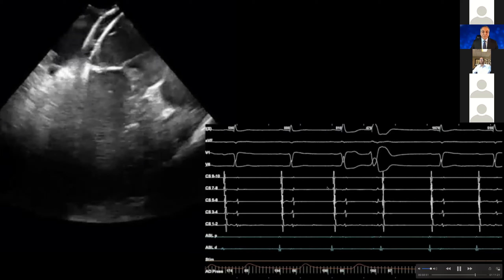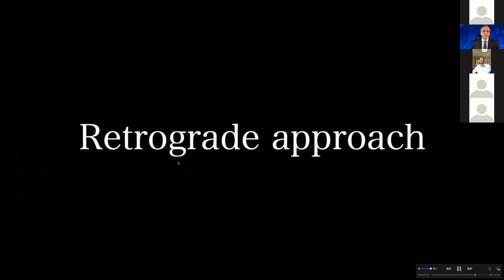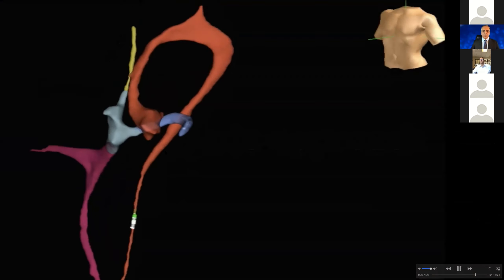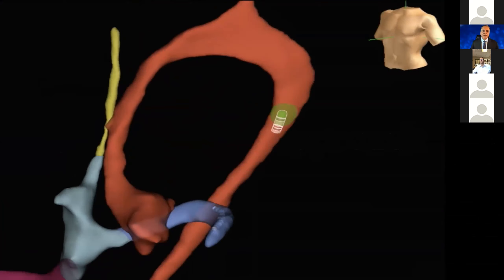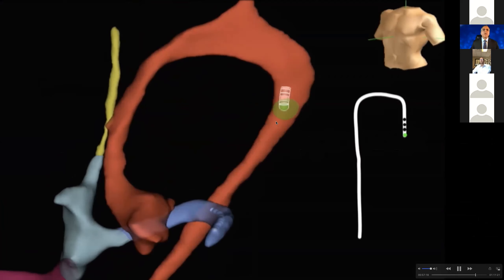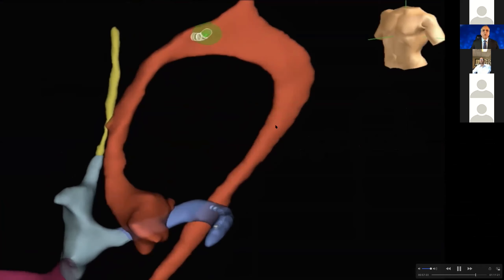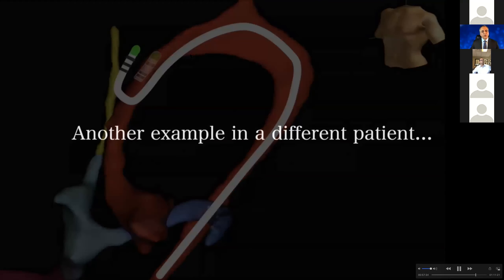Here you can see that there are no more atrial tachycardias. So lastly, we are going to talk about ablation of LV PVCs. Either you can go retrograde or antegrade approach depending on where you think your PVCs are. But I almost always perform the U-curve and candy cane inside the descending aorta — I believe it is much safer to do so. I am able to see that the green mark goes down, and when advancing towards the ascending aorta, I'll be able to see the tip of the ablation catheter looking up, meaning there is going to be a U-curve ahead of it.